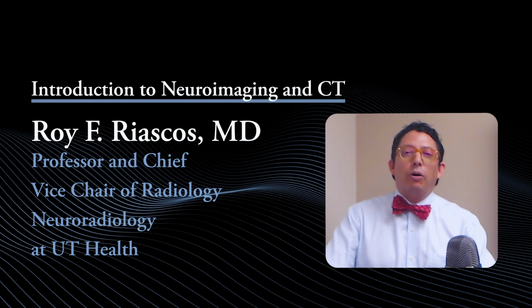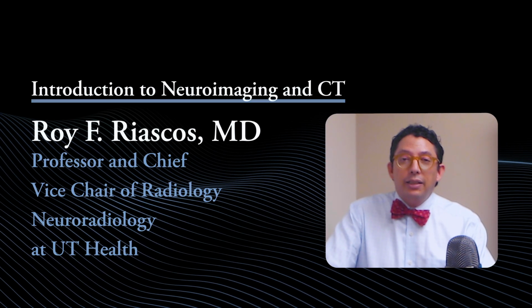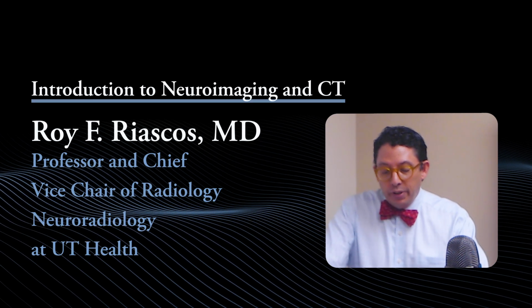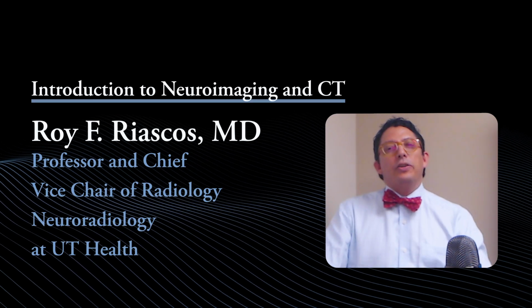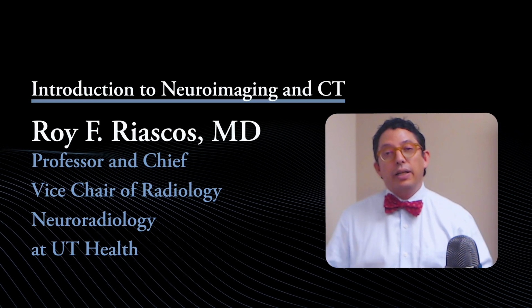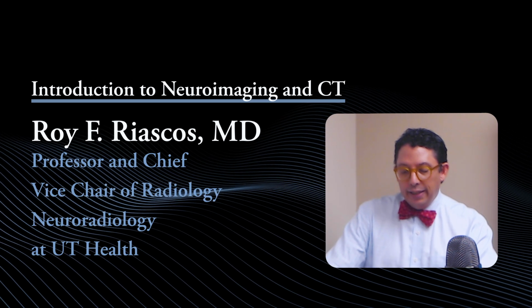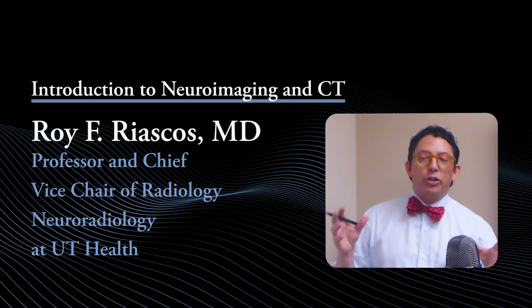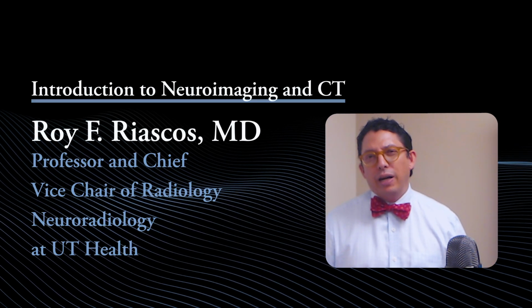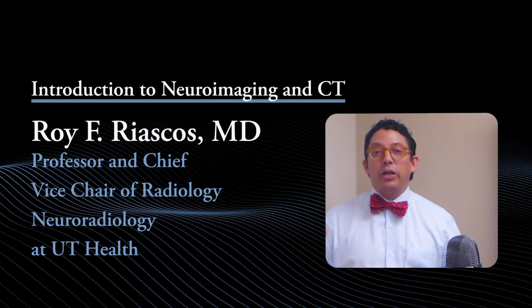When we're talking about neuroimaging, of course, imaging of the head with a CT is the most frequent one that we're going to be looking at. One very important concept that you need to understand when we do CTs, which again is based on X-rays, is that CT has too much information than can be displayed for the human eye. The human eye can only see so much of the information that you get with a CT.